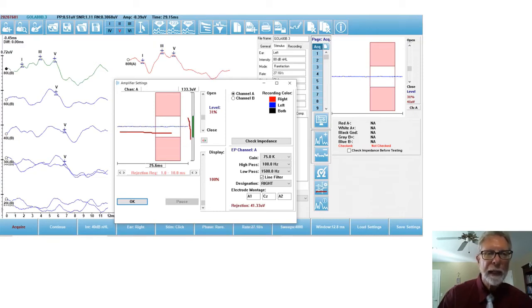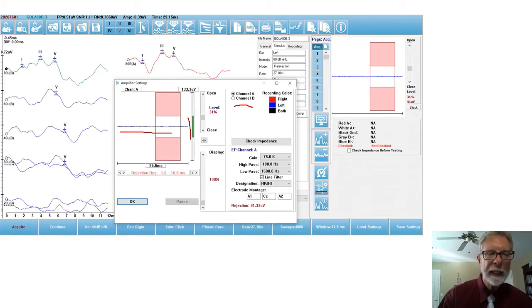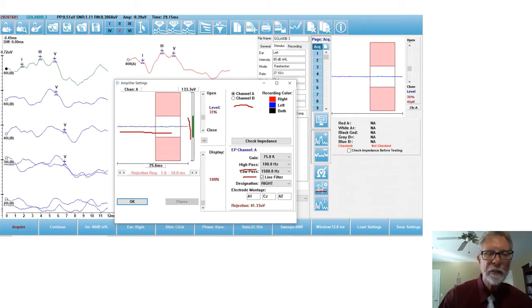And I can do it for channel A and B, channel one and two. And of course, I can change my gain. I can change my high pass filter. I could change my low pass filter. All of that is adjustable here.